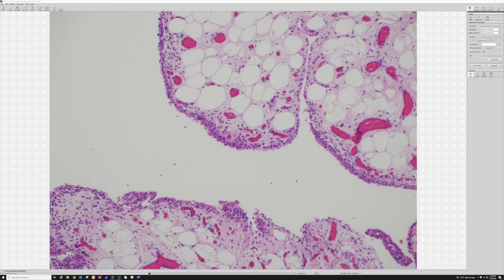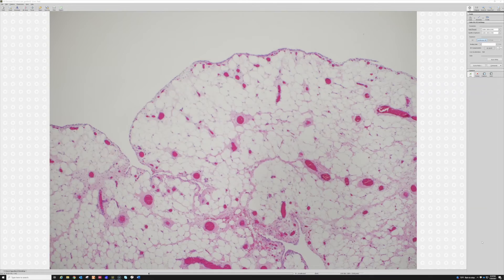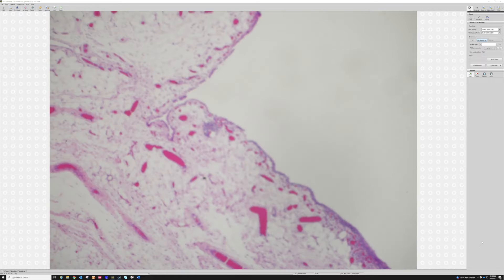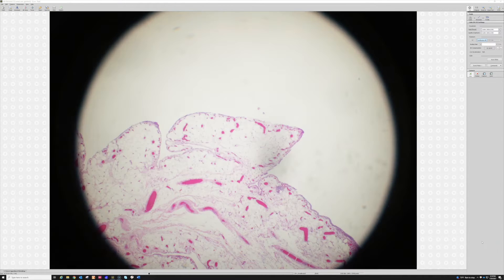So if you're a beginner, that's how I recognize synovium — it's a lining of cells with rounded nuclei but nowhere near as organized as a real epithelial layer, because these are not really an epithelium. We do have a synovial-lined space, so we're either in a joint or a bursa, but given this big huge slab of tissue, we're in a big joint.